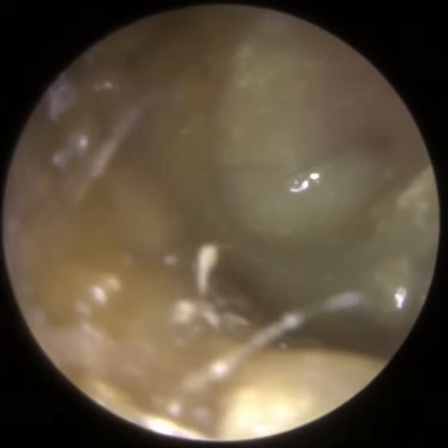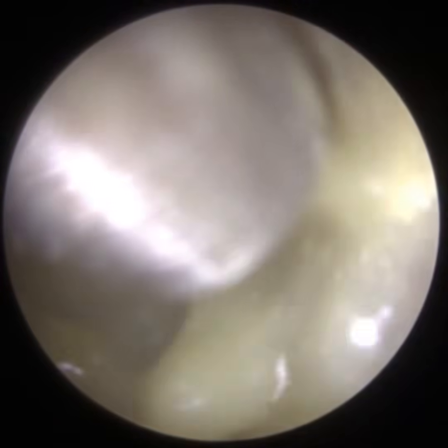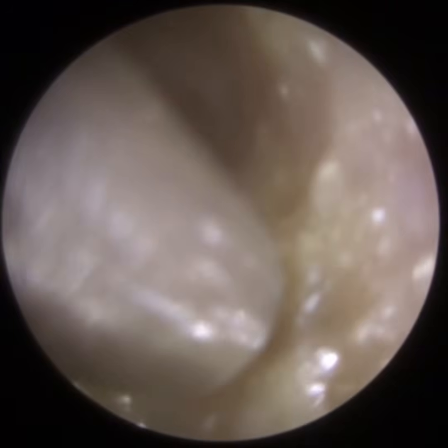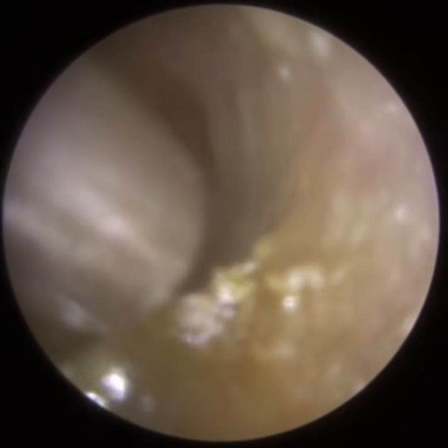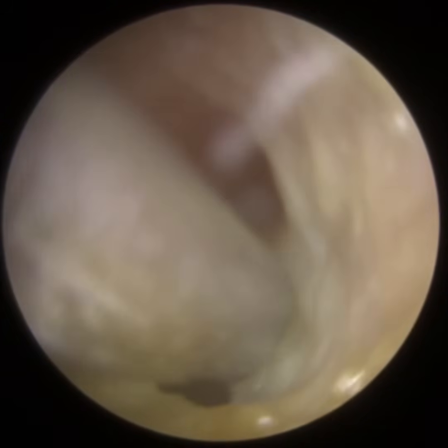Now we come on to the patient's left ear. You can see here, the skin more medially has become infected, damp and wet. The undercoat of skin, I wouldn't say it's crusted like the right, it's a bit more sticky, but it is a lot firmer than all this wet debris, this ear pus. What I'm trying to do is remove as much pus as I can.